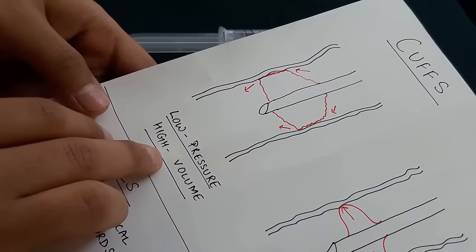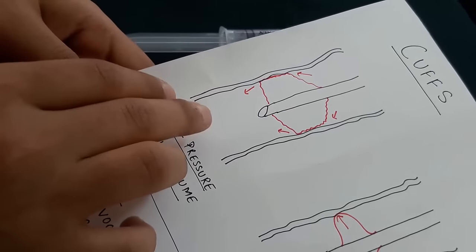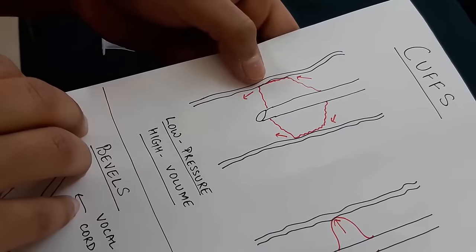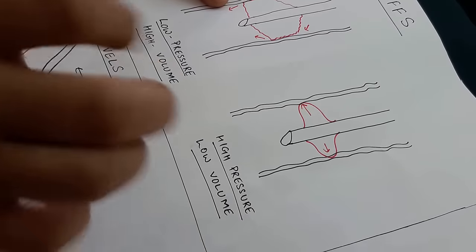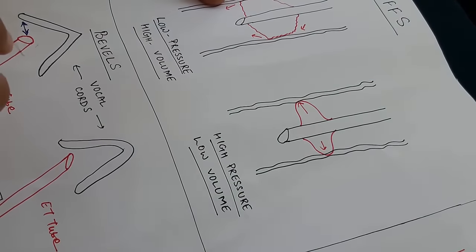As you can see in the diagram, there are two types of cuff: low pressure high volume, and high pressure low volume. The advantage of the low pressure high volume cuff is that there are less chances of tracheal necrosis and ischemia. However, the disadvantage is that due to its larger contact area it can run into folds, increasing chances of aspiration. In high pressure cuffs, the seal is good but it results in higher tracheal necrosis and ischemia.